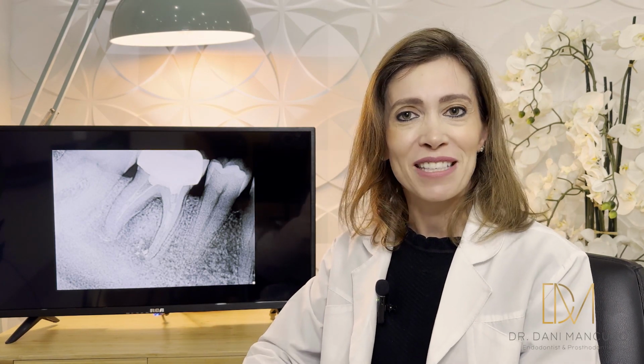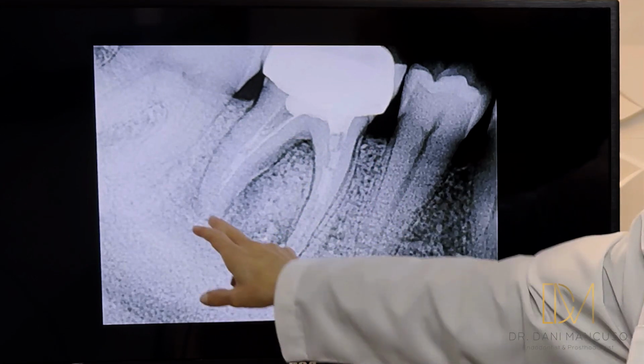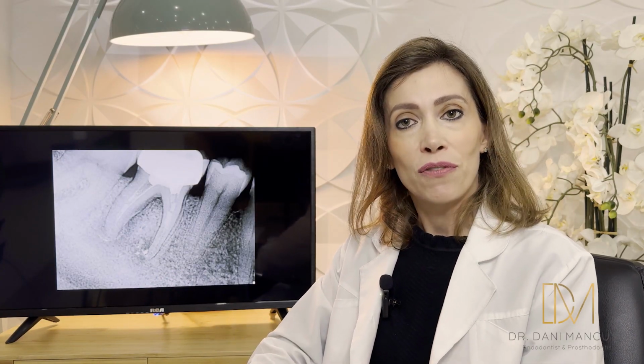And I said, okay, fantastic. Just go, you are safe, you are with the dressing. And when you come back, we will be able to finish. After 2 months, we took an X-ray and the calcium hydroxide was still in there. You can see a little bit absorbed already. And we said, yeah, it's ready for us to finish.